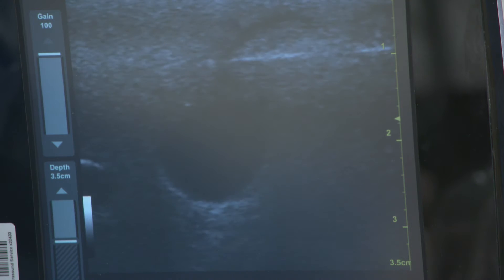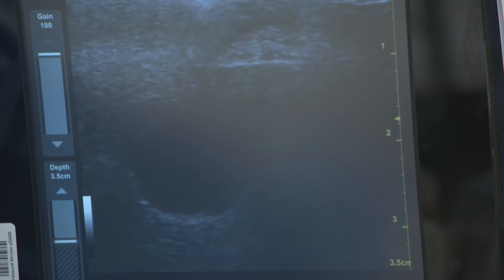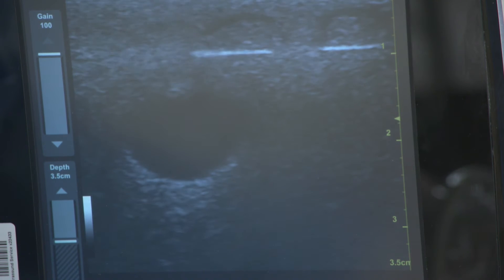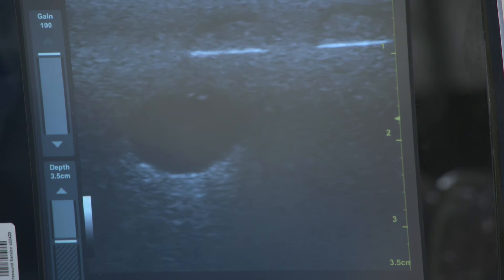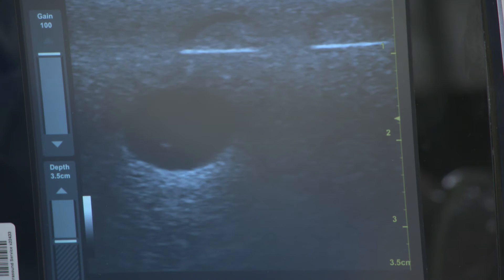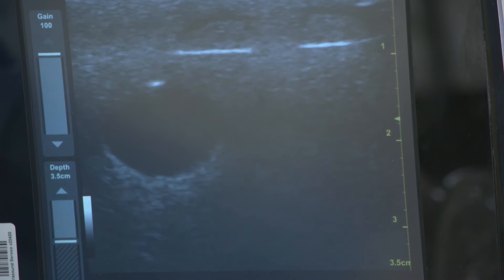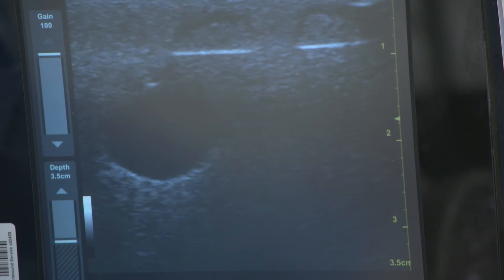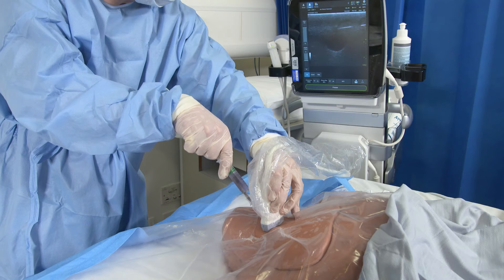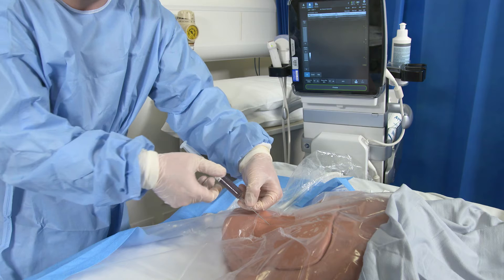From what I was talking about earlier, if you change the orientation of the probe you just get a little bit of needle in the centre. Whereas if you change again, you can see down from the top and happily into the vessel. Sometimes in real patients this vessel will be a lot more collapsible. Doing things such as asking them to breathe out and hold their breath or tilting the table down will help you in your insertion. When you're in the vein, you should be able to see it on the monitor and should also get easy aspiration of blood.